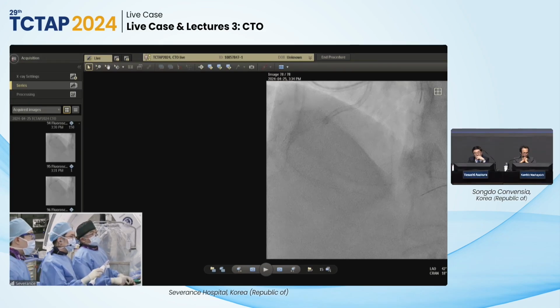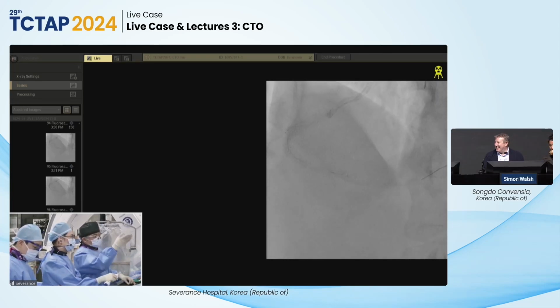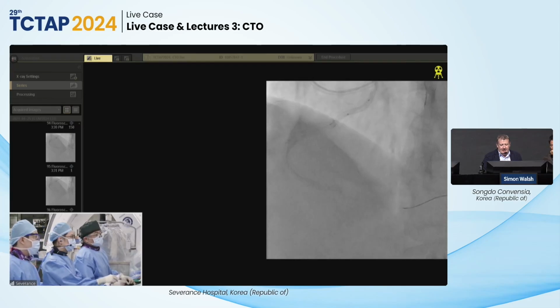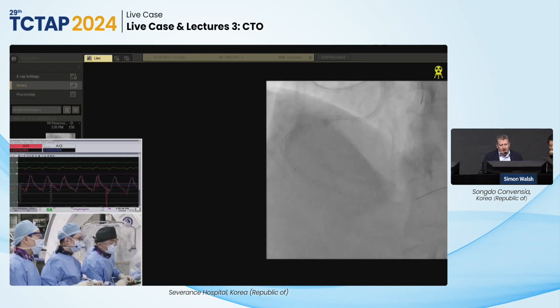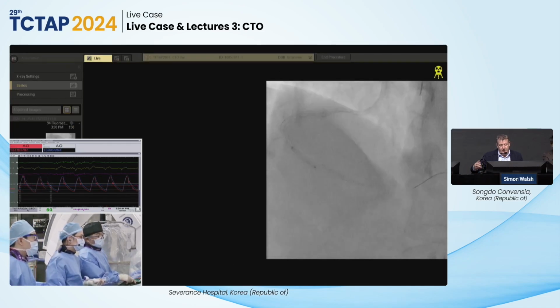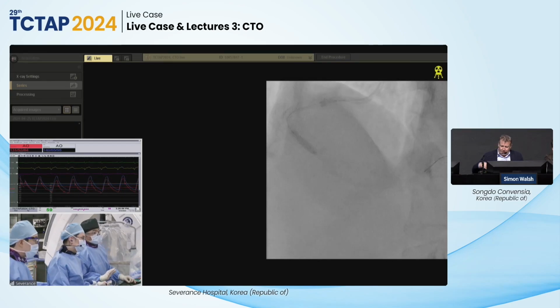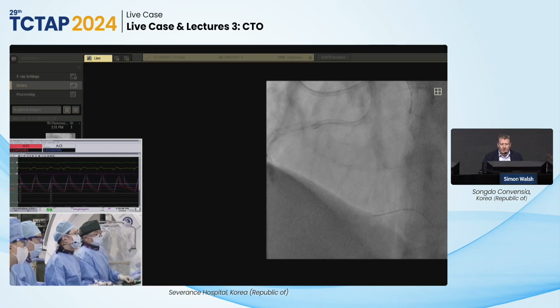Simon, what do you think about the distal portion treatment? Can I sit on the fence? In your usual case? Yeah, I think there's distal diffuse plaque. I think where the stent has landed is probably okay. It's got a big area. There's a moderate plaque burden that's probably worth measuring. But there's such a short segment of it that I think chasing the stent edge itself isn't necessary, but the distal disease is at least moderate for sure. But I suspect if you put the IVUS right out to the distal vessels, you're going to see plaque all over the place here, so you can't chase it forever.